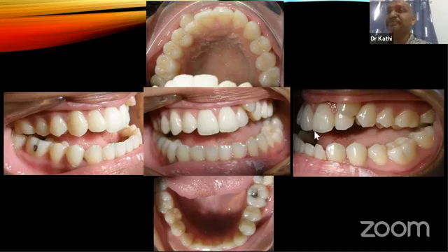So take a digital photograph, draw lines and measure, and see which part is not symmetrical. And also take a posterior anterior X-ray and draw the lines. I love to go into cephalometrics of posterior anterior, but not in this lecture.